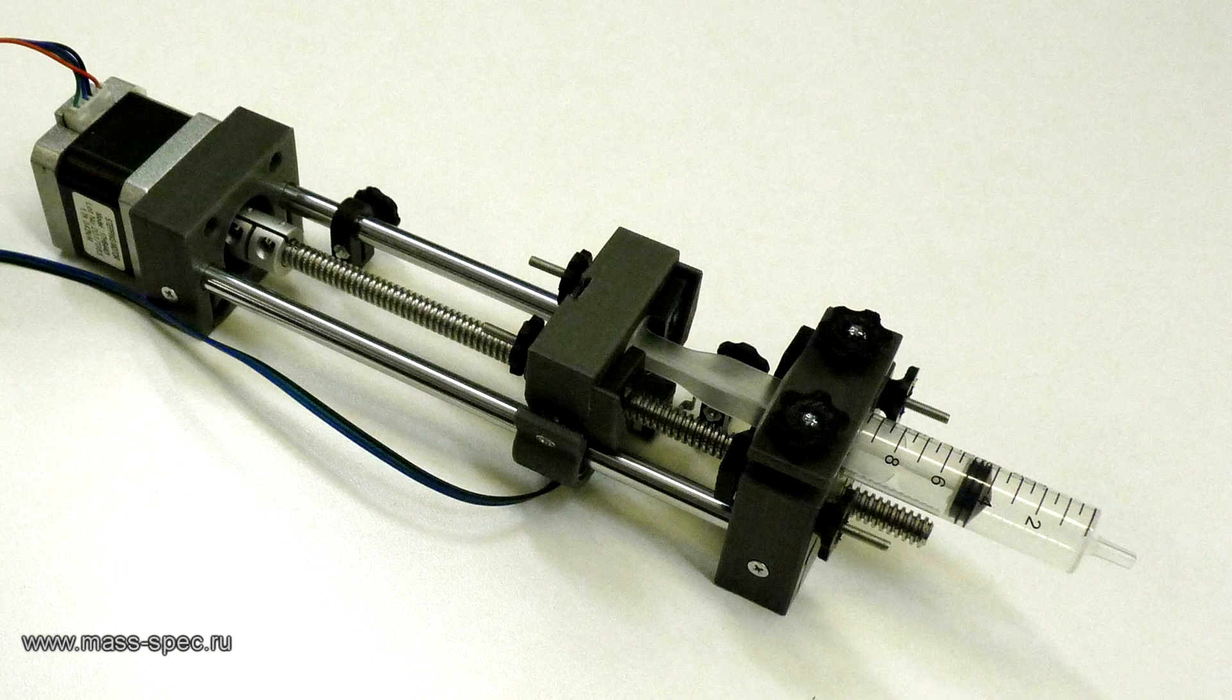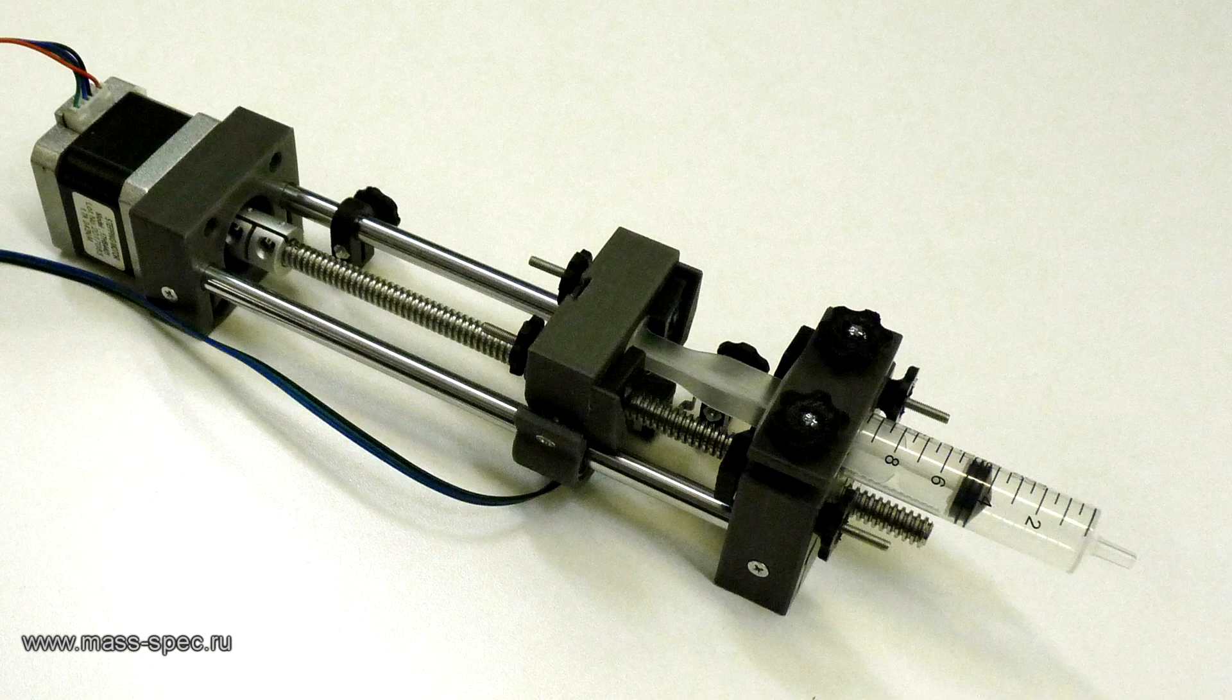Usually the exact inner diameter of a plastic syringe is unknown. Therefore, the first step is syringe calibration.